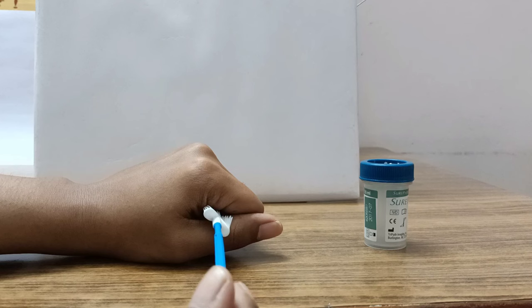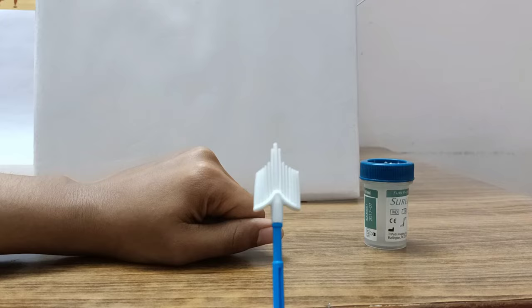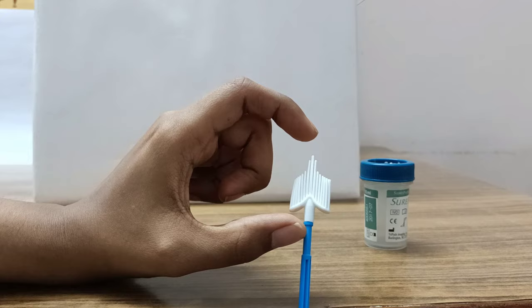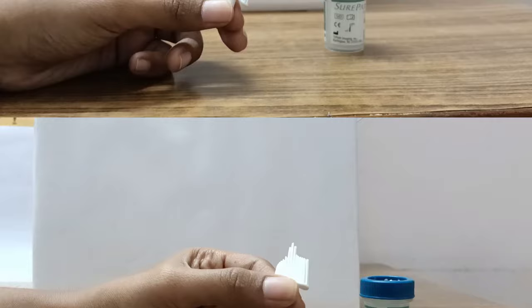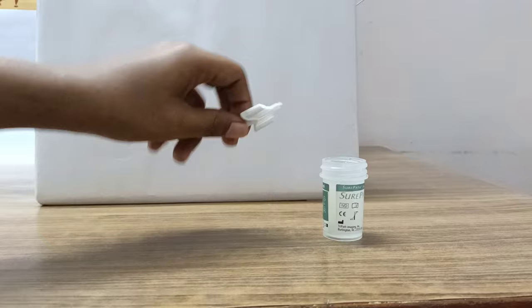After that I have taken enough cells and I am going to transfer this part of the cytobroom. It gets detached from here and the cytobroom is then put inside this SurePath vial like this and sent for liquid based cytology to the pathologist.